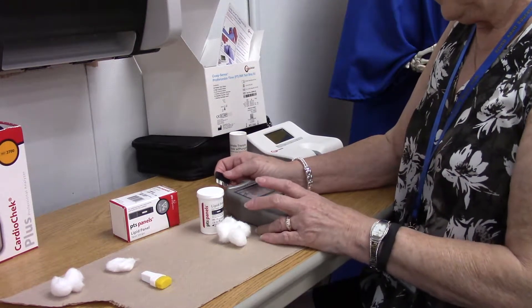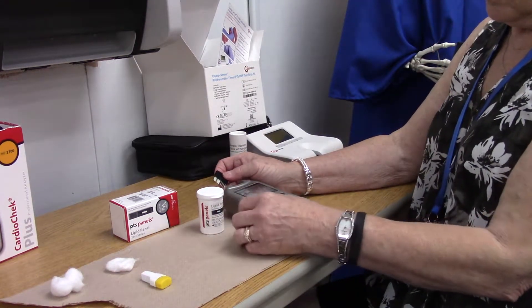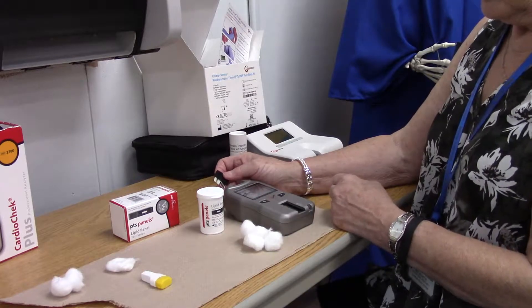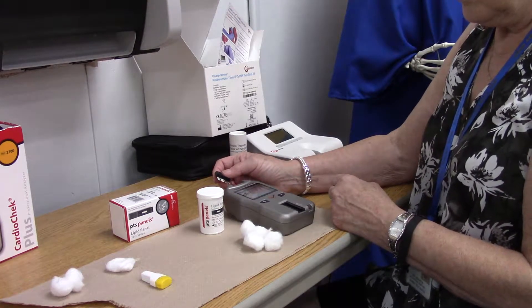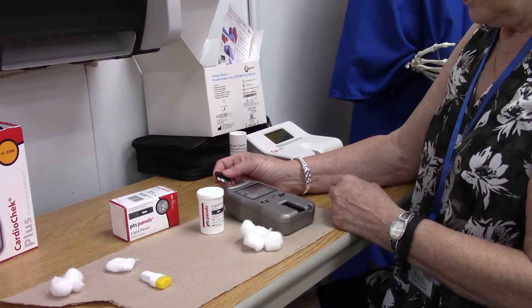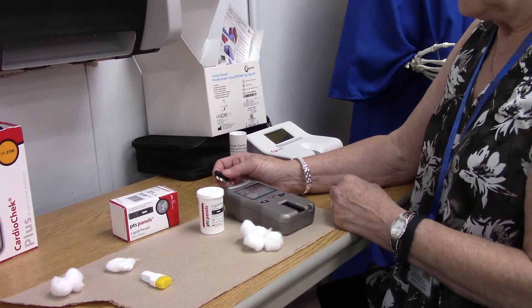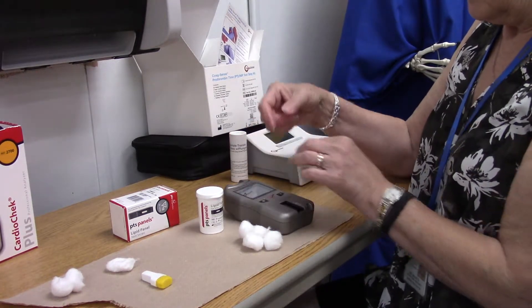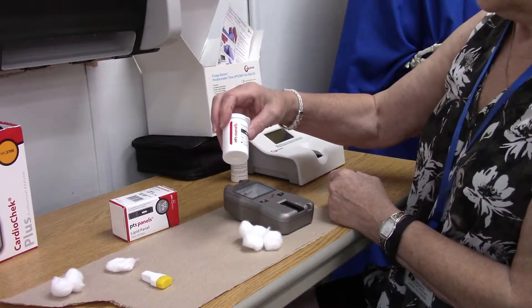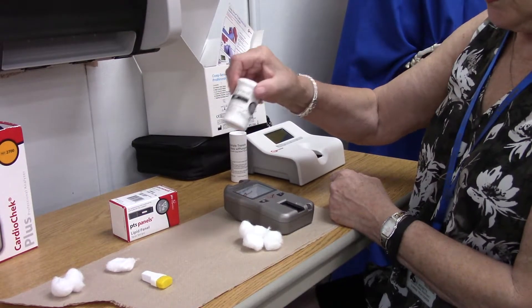We're going to do a lipid profile by capillary puncture. This will tell you your HDL, LDL, and total cholesterol. The test strips are in here — they are light sensitive.